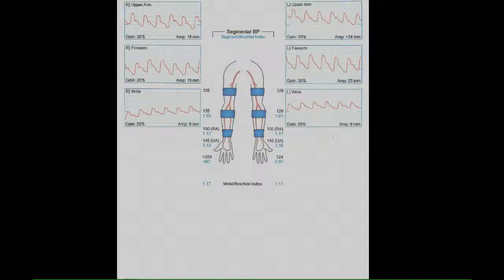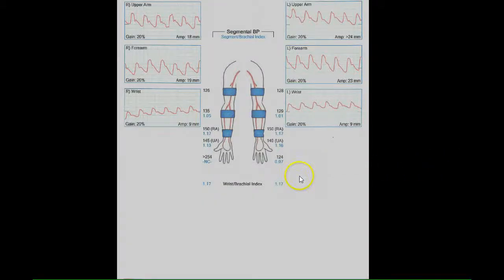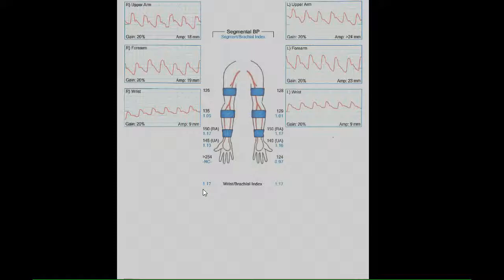This is an upper extremity arterial pressures and waveforms examination with cold immersion performed on a patient with finger pain. First, we will note the wrist brachial indices, here and here, which are greater than 0.9 bilaterally and are therefore normal.